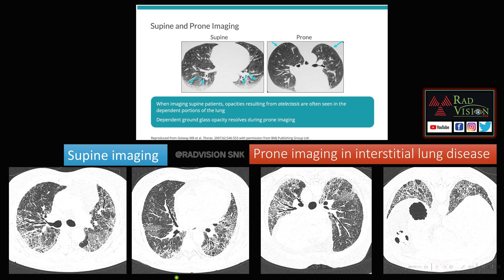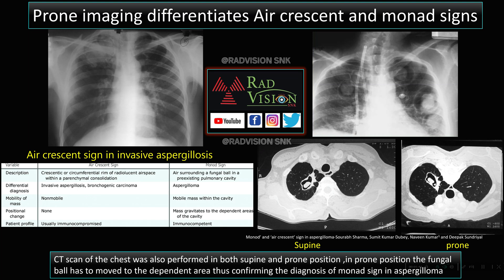In this other case, this is an ILD imaged in supine position. However, in prone position the pathology persists — ground glass opacity, interstitial septal thickening, honeycombing, and bronchiectatic changes are seen in the lower lungs on prone imaging. Prone imaging is therefore useful in differentiating basal atelectasis from interstitial lung disease.